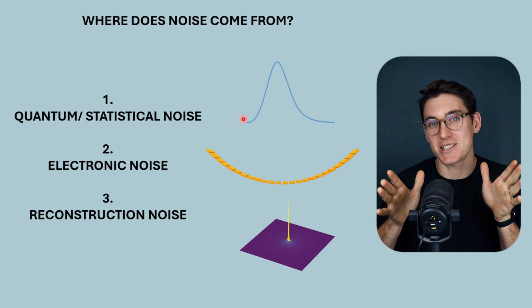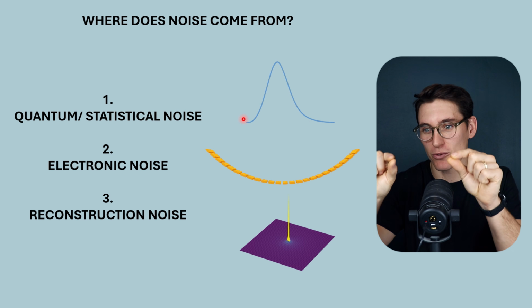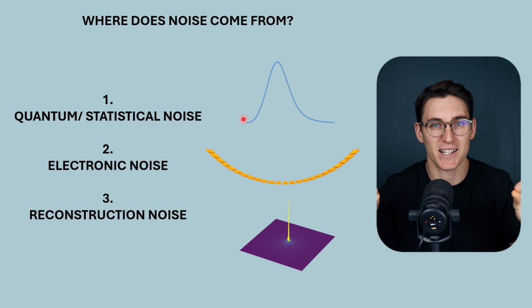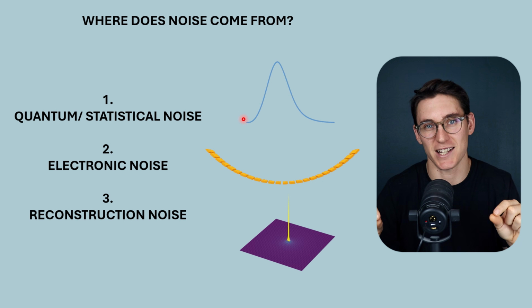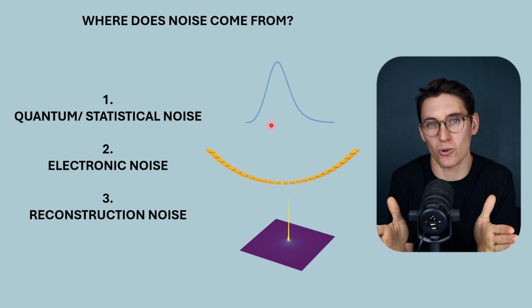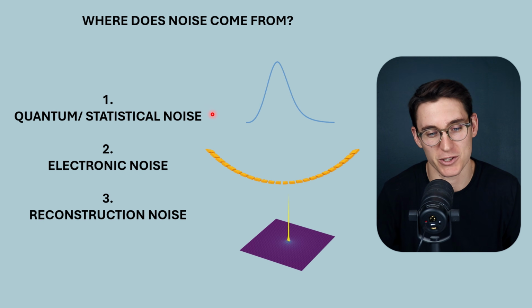When an X-ray beam is heading towards an array of detectors, the actual number of X-rays that are going to fall on each of the individual detectors is going to vary slightly from each detector to the next. And that variance, that standard deviation in the number of X-rays that land on those detectors, is described by Poisson noise distribution. That randomness of how X-rays fall is what's known as quantum noise, and that's the predominant cause of noise in an image.